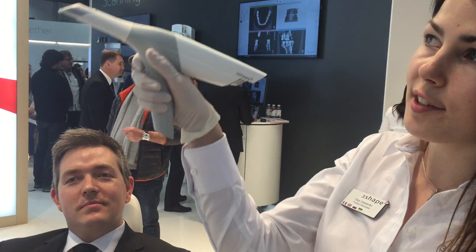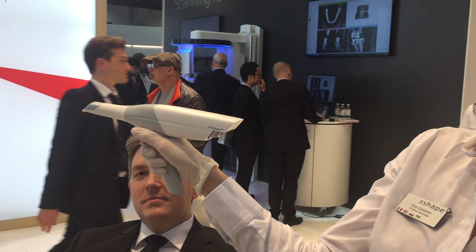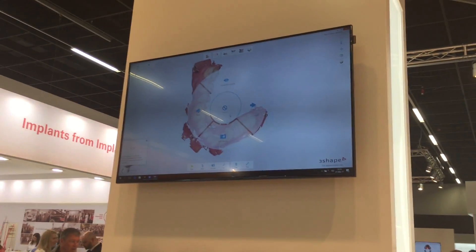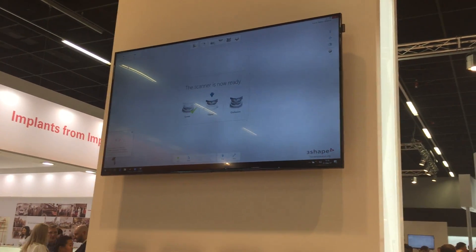So, just by clicking the button of the scanner, I can decide to go to the next step of the scanning. I just decide to go next without having to actually use the mouse or the keyboard.